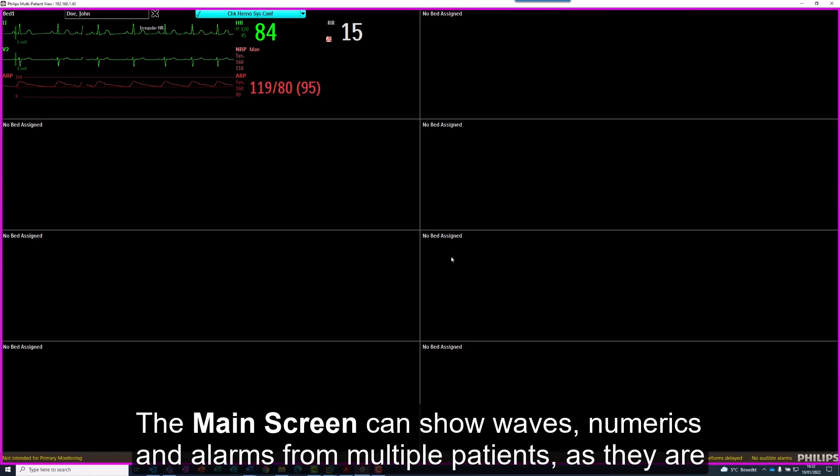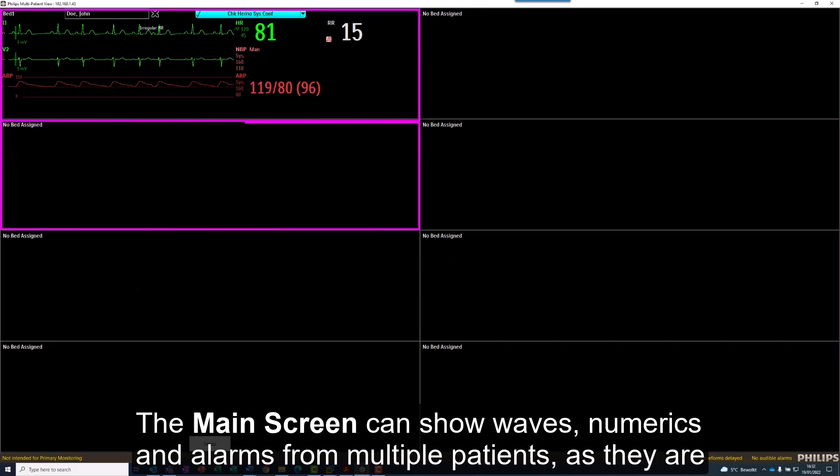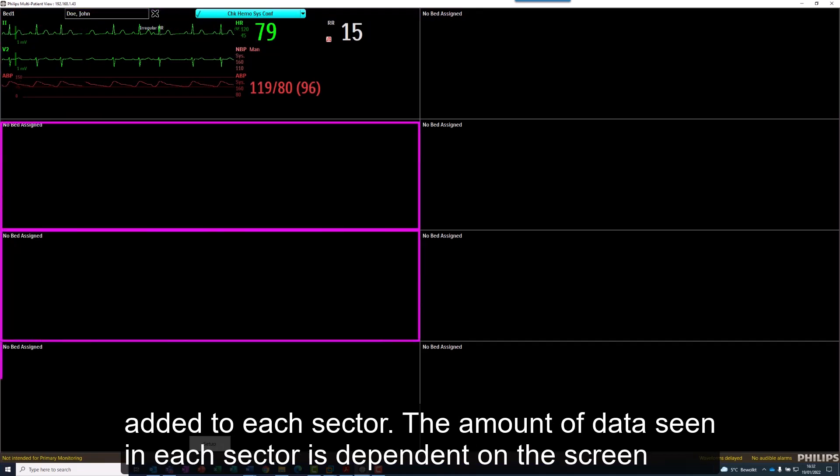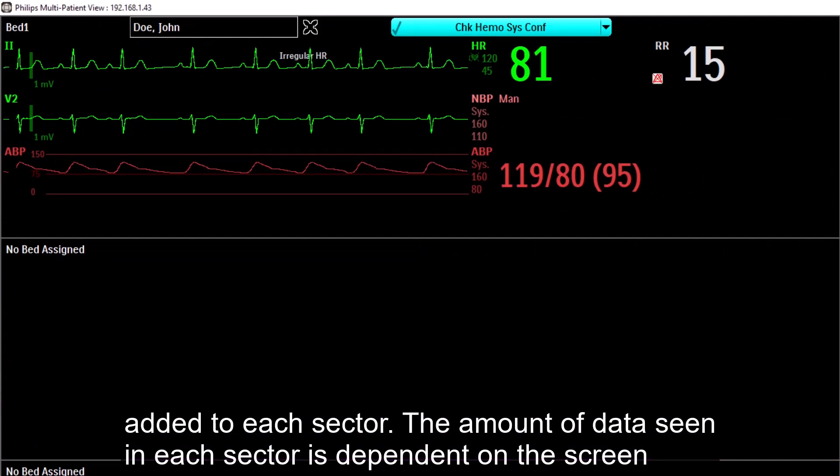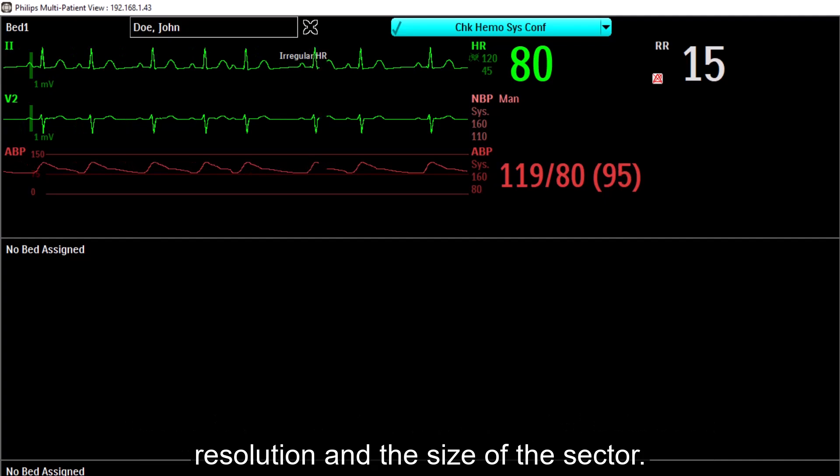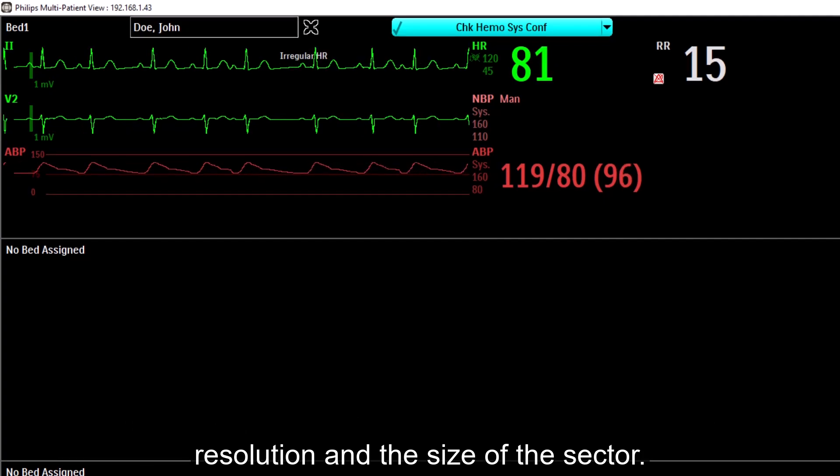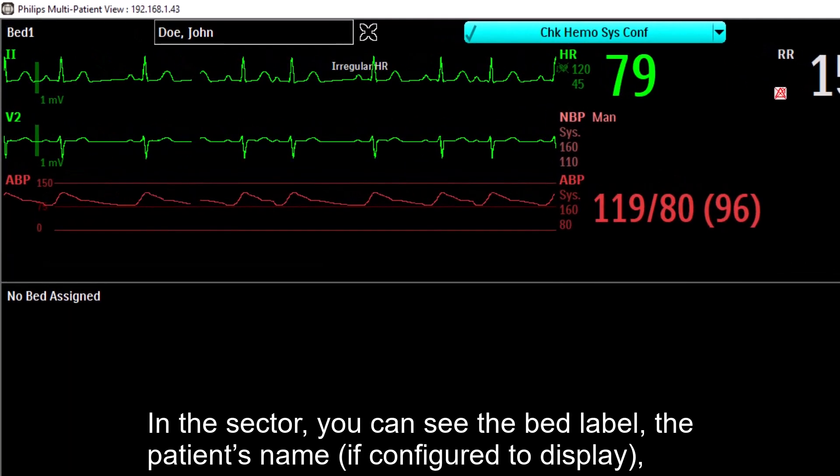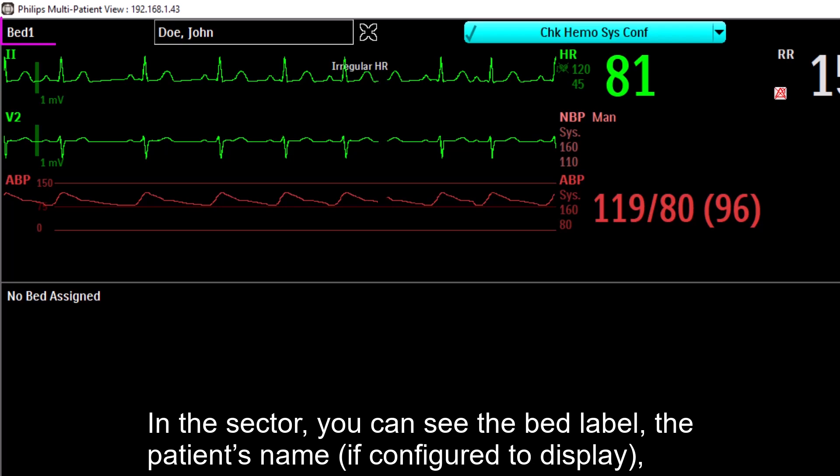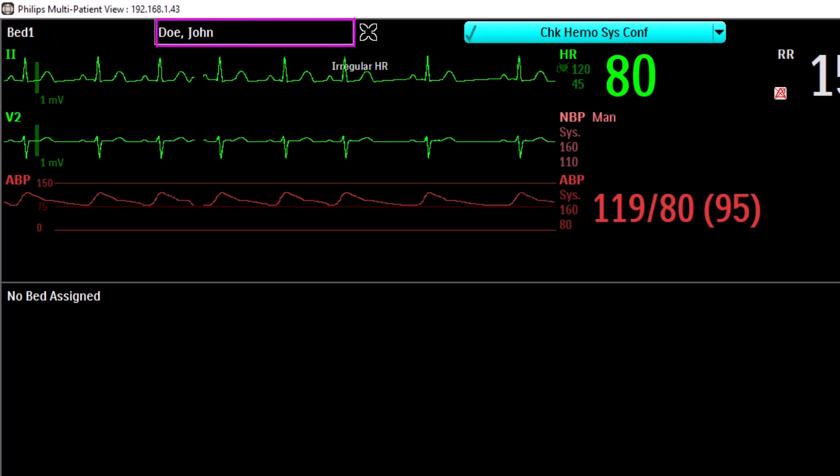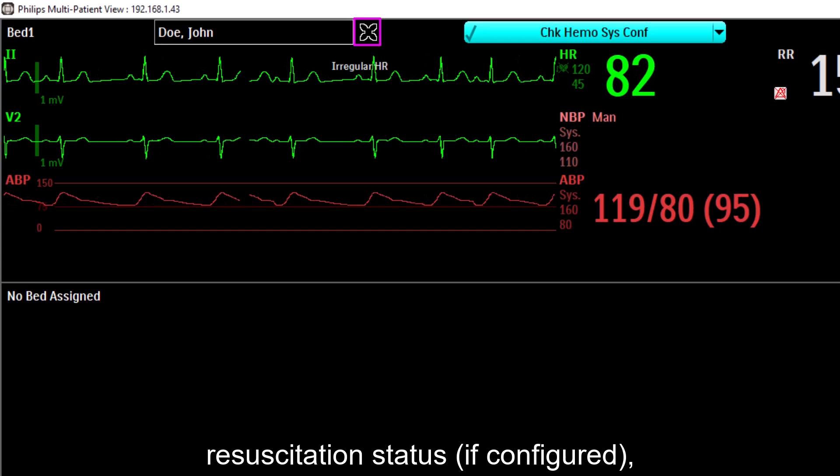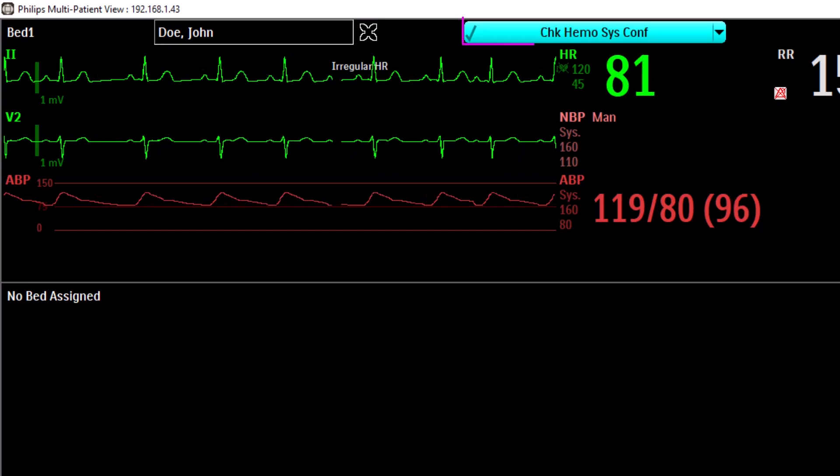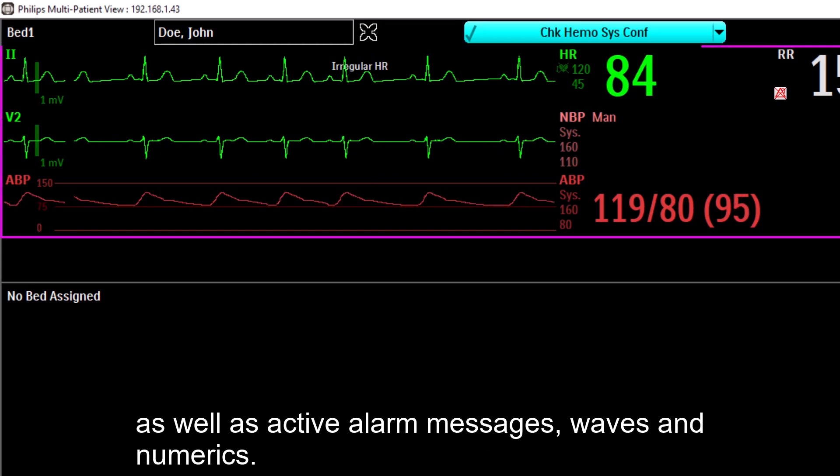The main screen can show waves, numerics, and alarms for multiple patients as they are added to each sector. The amount of data seen in each sector is dependent on the screen resolution and the size of the sector. In the sector, you can see the bed label, the patient's name if configured to display, resuscitation status if configured, as well as active alarm messages, waves, and numerics.